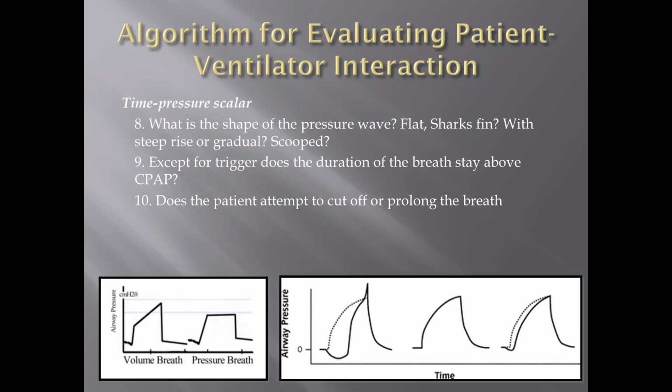What's the shape of the pressure wave? We'll talk about this in a minute, but what is this indicative of? It's also indicative of flow asynchrony or flow starvation, that they're not getting enough flow. Yeah, we'll talk about that more.